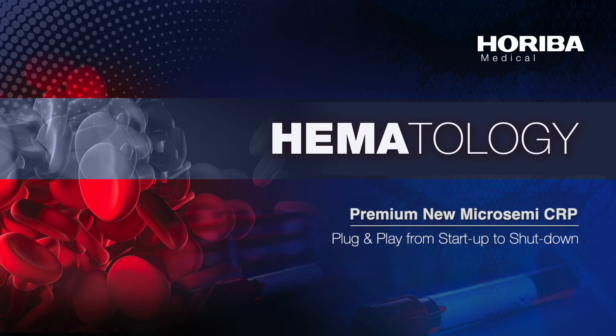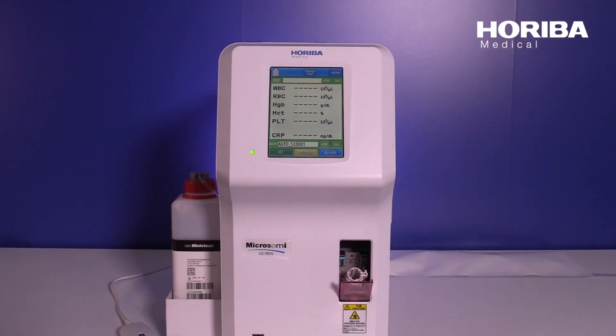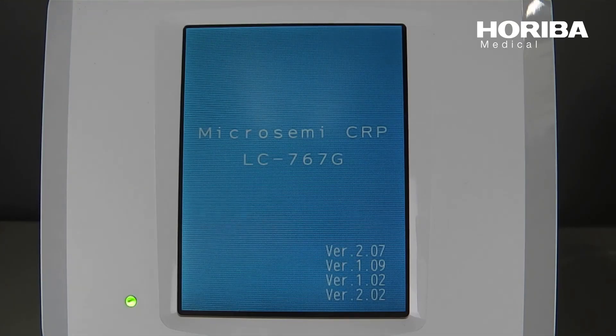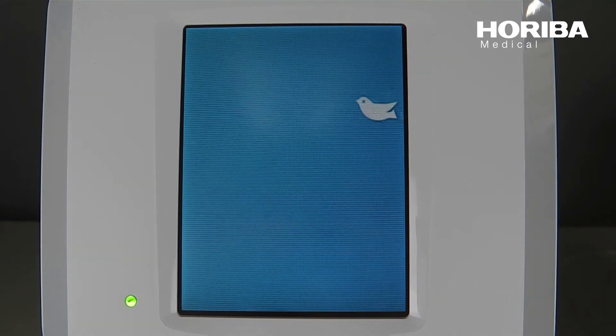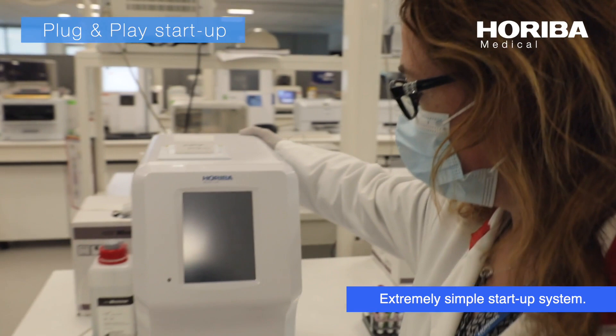What is the system start-up system? Extremely simple system start-up.